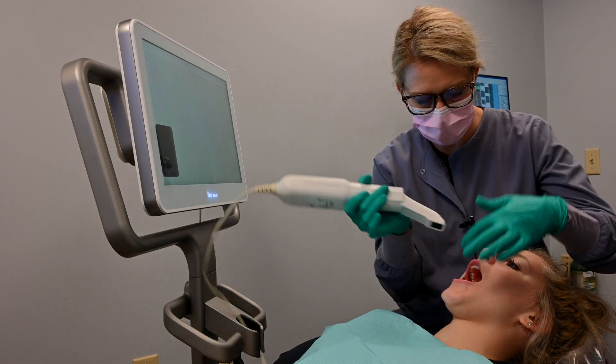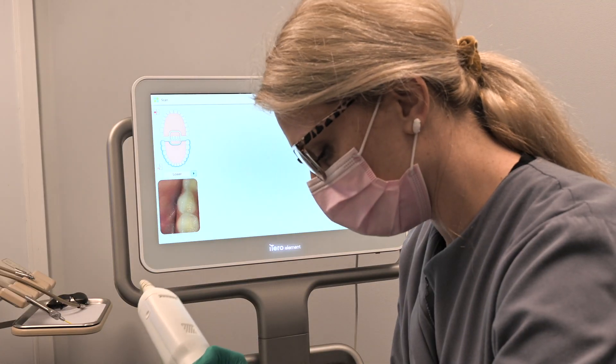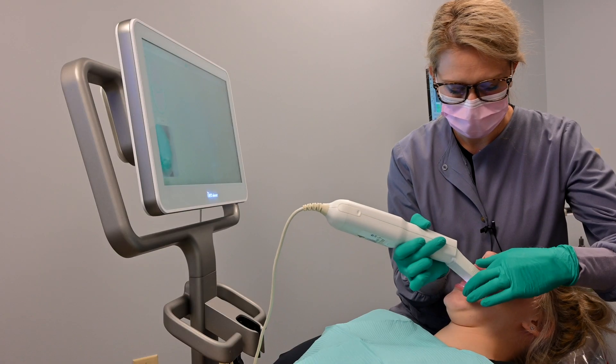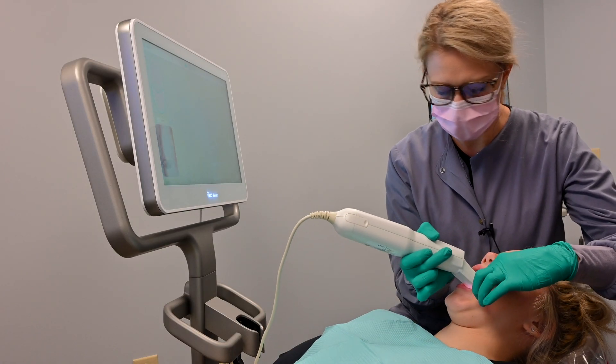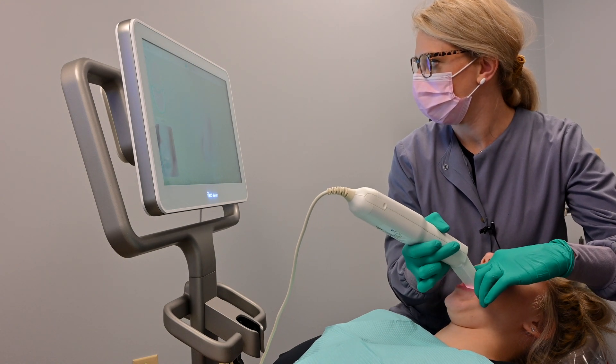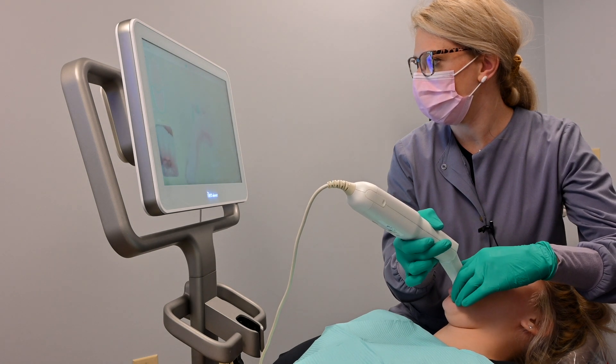So we're going to scan your lower teeth here first. It might be a little bulky. If anything is uncomfortable, let me know and we'll try to adjust it the best we can. You'll just feel me move this camera over top of your teeth.